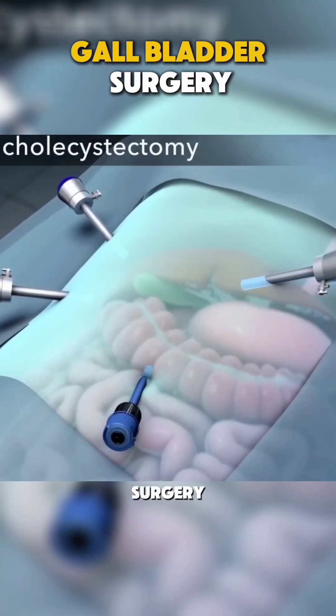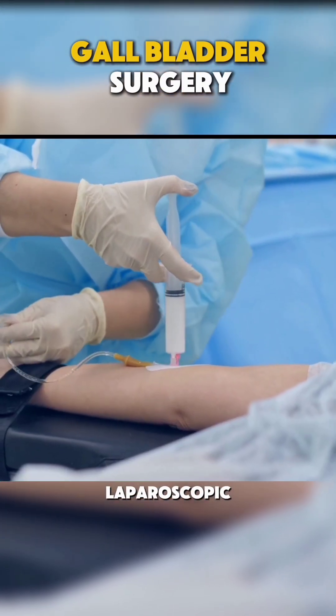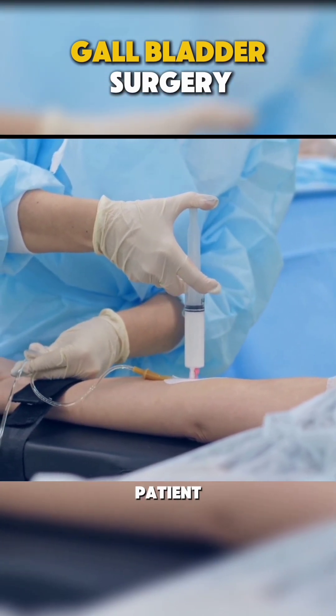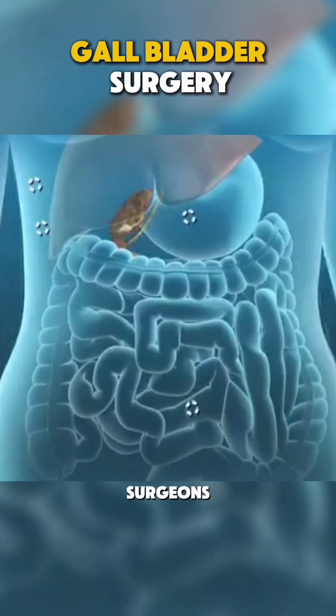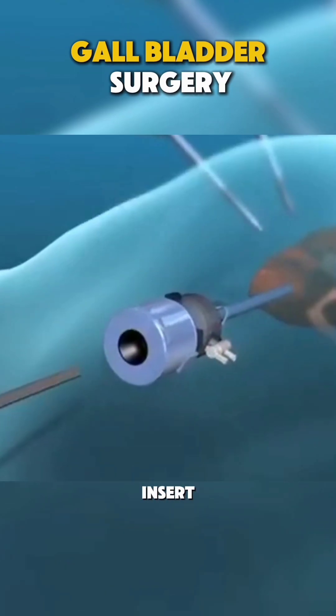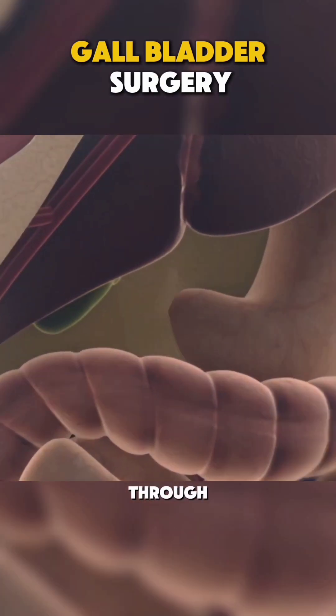There are two types of this surgery: laparoscopic and open. For laparoscopic cholecystectomy, the patient is put under general anesthesia so they won't feel a thing. Then, surgeons make a few small incisions and insert a laparoscope, a tiny camera, to guide them through the procedure.